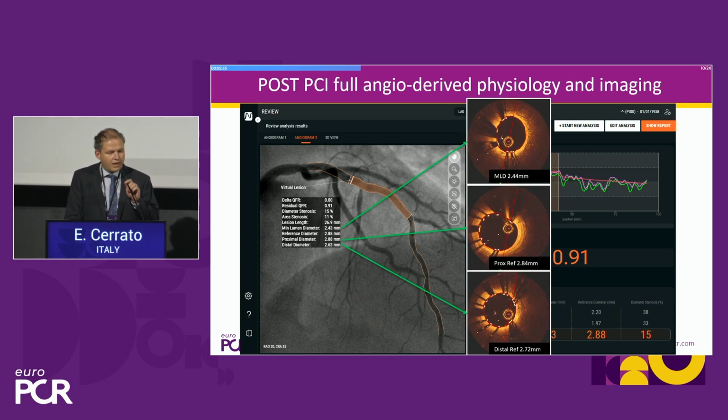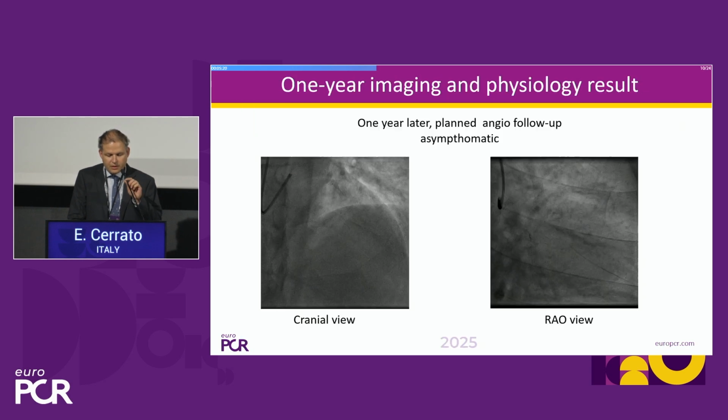And again, we can get information about optimal expansion, optimal position that was, again, very similar, if you look at the numbers, comparable to those provided by the non-invasive angio by QFR.